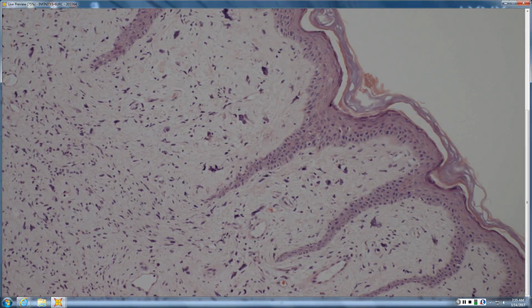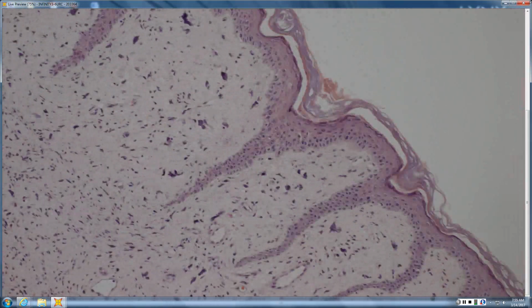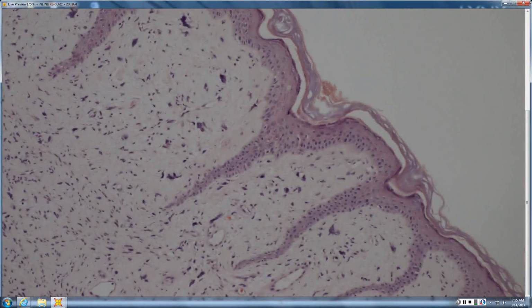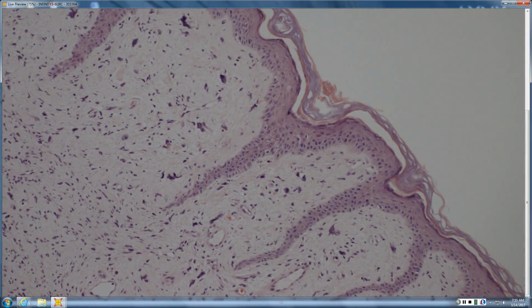A pleomorphic fibroma. So pleomorphic fibroma has no mitoses, has big, ugly, radiation fibroblast-looking nuclei, but they are just randomly peppered across the lesion. Big radiation fibroblast-like nuclei, but just randomly peppered across the lesion.